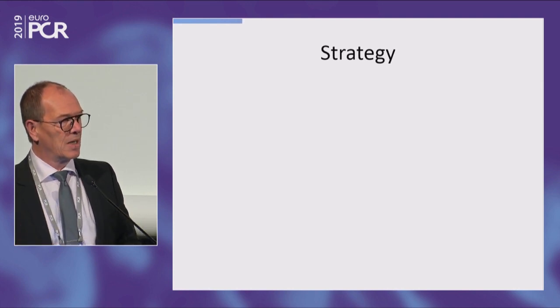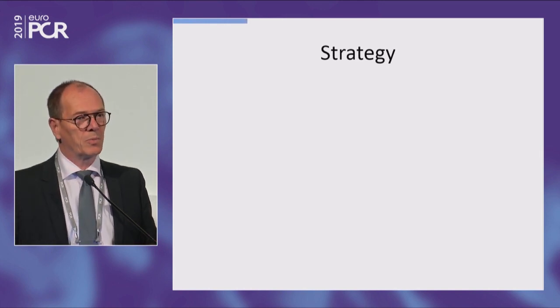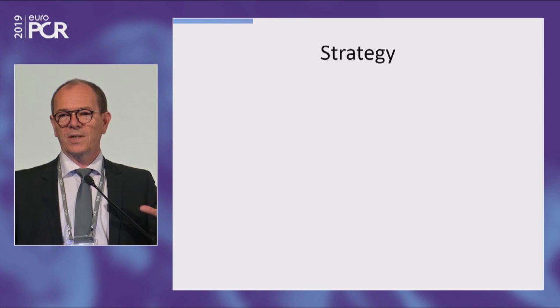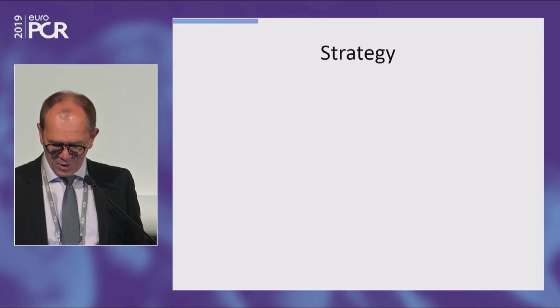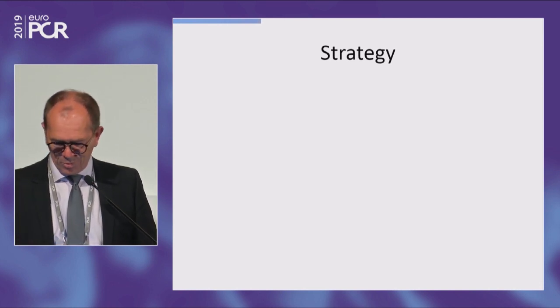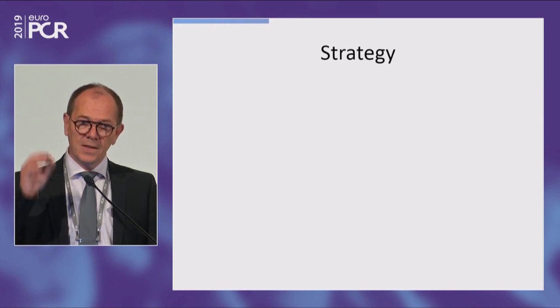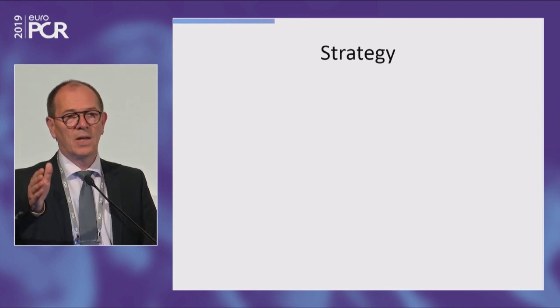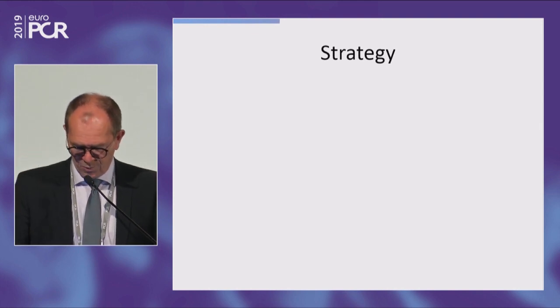This is a new tool, and personally, I miss some information about the compartment. It's like a Canada Dry, you know? It looks like a tubular stent with integrated port, but this is a new guy, completely different. We are still working on bench, but we don't have all the final data, but we can open the discussion for later. So the strategy was, we want first, if we do something, to save the patient. And in this way, we are going to make a provisional T stenting. Let's go to open left main, LAD, and let's see how we can deal with the circumflex.